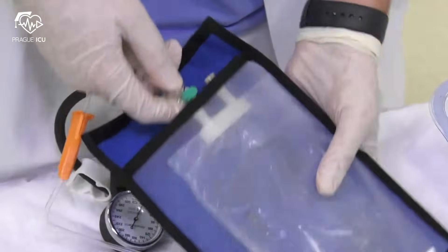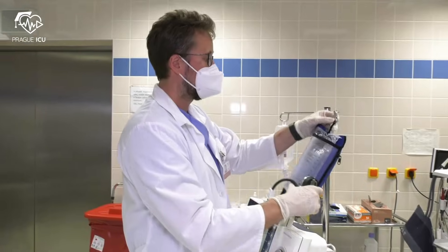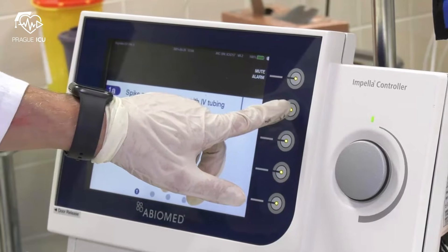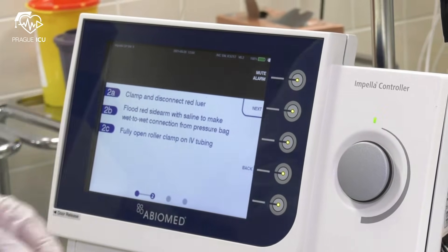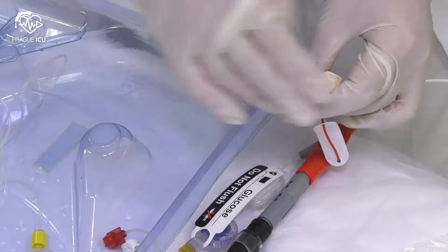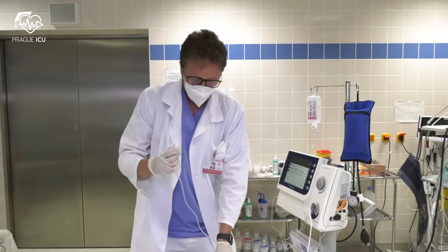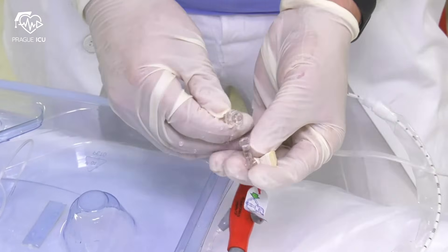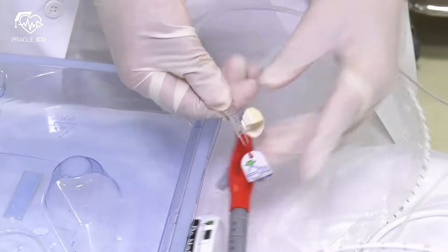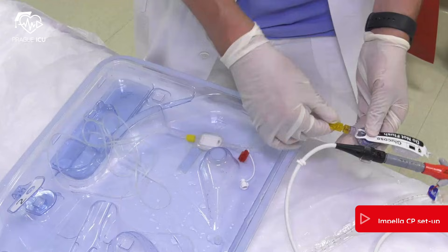Spike straight IV tubing to the saline bag and insert it into the pressure bag. Pressurize the pressure bag to 300 up to 350 mmHg. Push next, then clamp and disconnect the red luer sidearm while the regulator on the IV tubing is closed. Open the IV tubing regulator allowing leakage of saline and make a wet-to-wet connection of the sidearm.